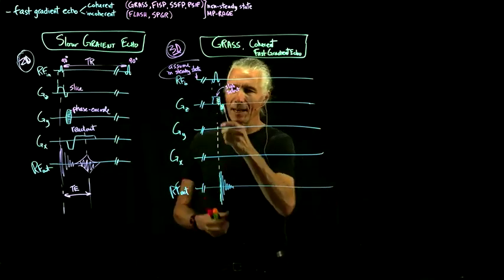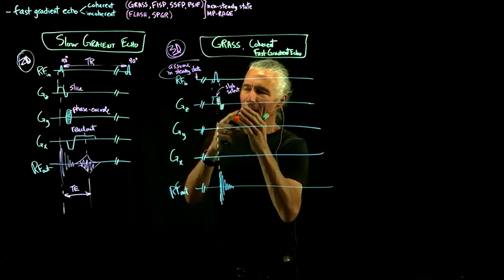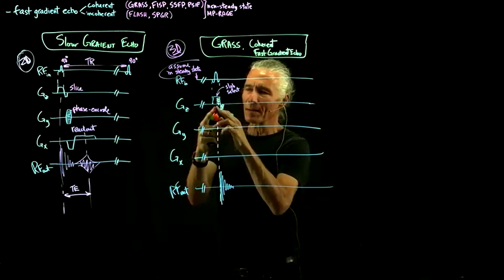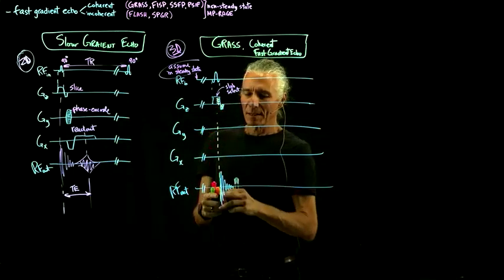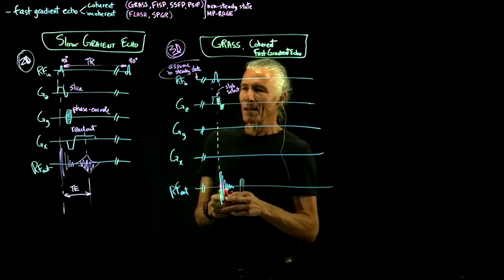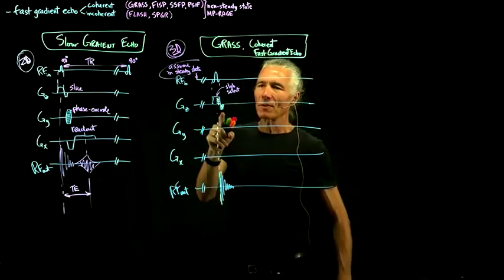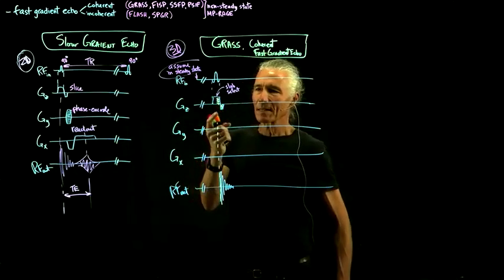At the very beginning, not too many people are lined up with each other, and at the end, there's a lot more lined up, and you can approximate that by pretending the RF pulse started at the very middle of it, and so the amount that you have to actually fix starts from the middle.